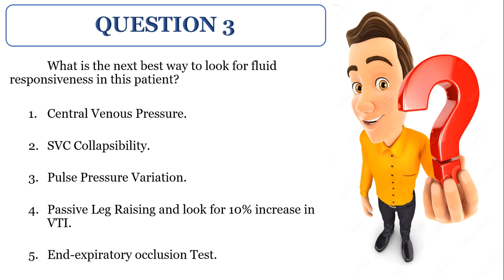Abdominal compartment, feasible नहीं है, valid नहीं है, because this patient is in atrial fibrillation. All patients, SPV, PPV, सारे चीजें के साथ SVC collapsibility and IVC distensibility also is not valid in patients with cardiac arrhythmias. So it's not valid. Pulse pressure variation, not valid.